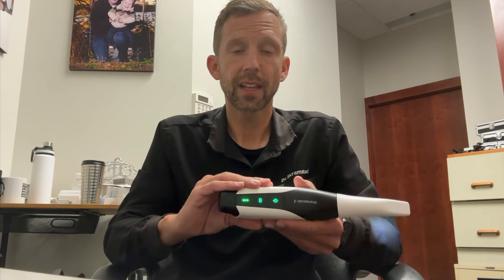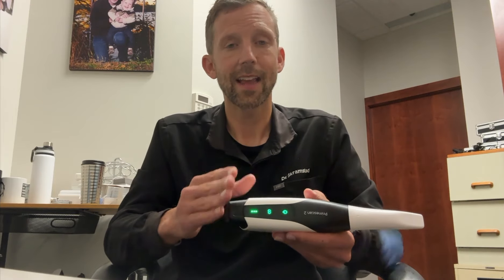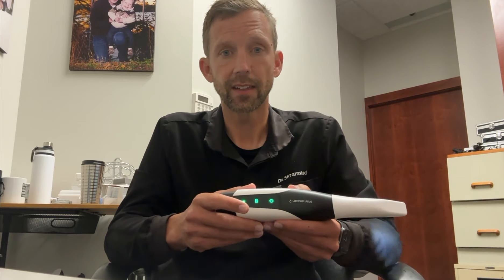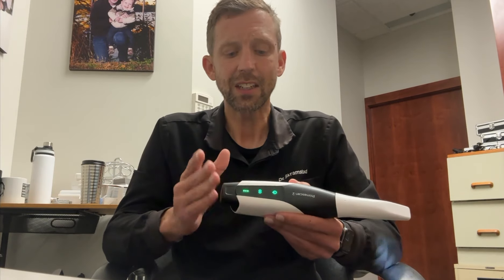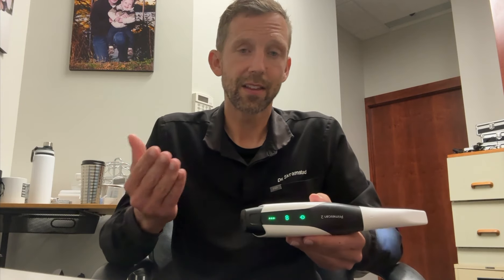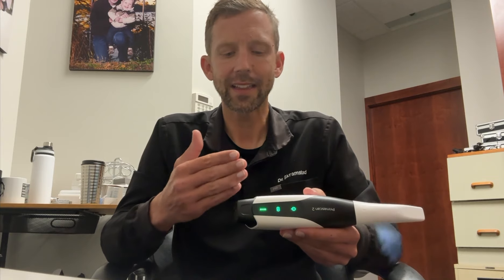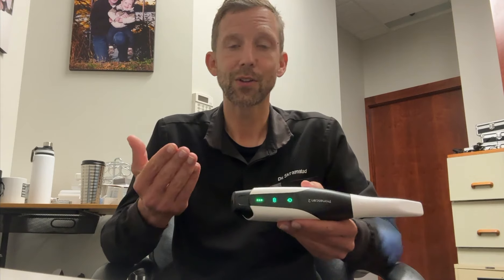The beauty of the PrimeScan 2 is not only is it wireless, not only is it portable — I can go room to room and scan all my patients — but it's the first cloud-native scanner that's ever been invented. I really want you guys to let that sink in, how innovative this is. This has never been done before. The ability to go to any room that I want, just open up Google Chrome on any computer or device and scan directly to cloud. Now you think it won't be fast, but it is incredibly fast — this is scanned and uploaded into DS Core within seconds.